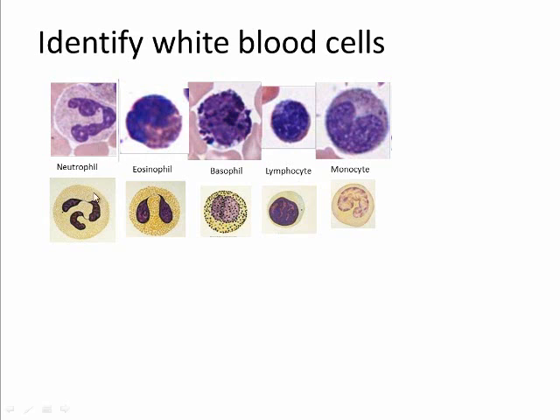Also, these have granules. These have kind of lighter, smaller granules. These have big red granules, and these have big blue granules. Oftentimes you can't see the nucleus very well of a basophil because the granules are above the nucleus. Now eosinophils lay down flat and the granules are on the side. So red granules or blue granules makes the eosinophil or basophil, or a neutrophil has granules too, but they're much smaller in size. In contrast, you have a lymphocyte, which has a kind of spherical nucleus and a spherical cell with a little bit of cytoplasm. So the nucleus is from here to here and a little bit of cytoplasm.